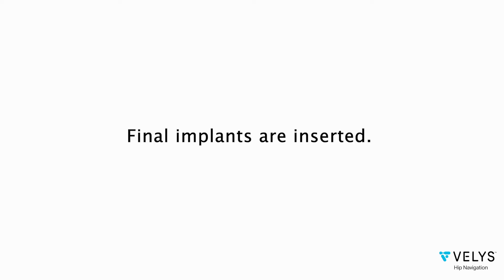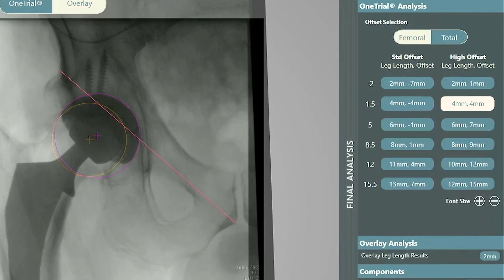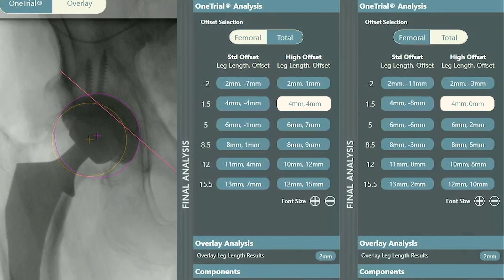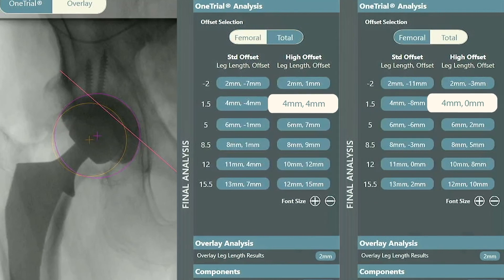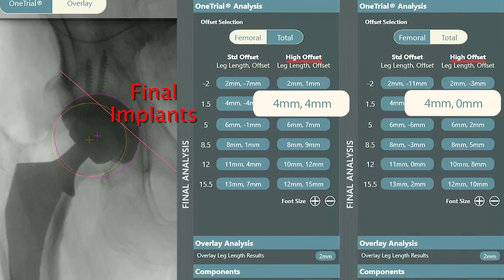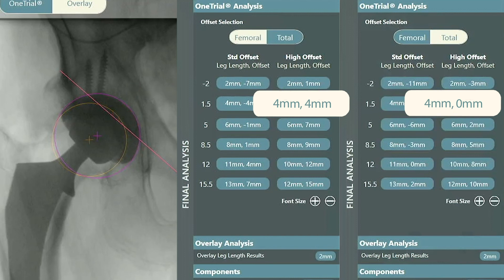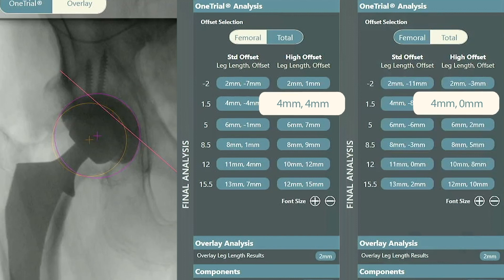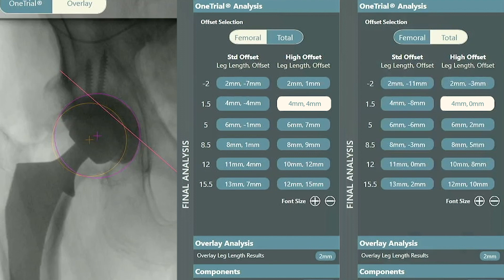The real implants can then be inserted and the surgery can end. In this case I opted to rerun the one trial with the final implants in place. The final numbers with the high offset stem are plus 4 millimeters of length, plus 4 millimeters of femoral offset, and a neutral total offset. I know from the data generated here that the patient's leg length has been restored and he will have a stable hip with these offset numbers.